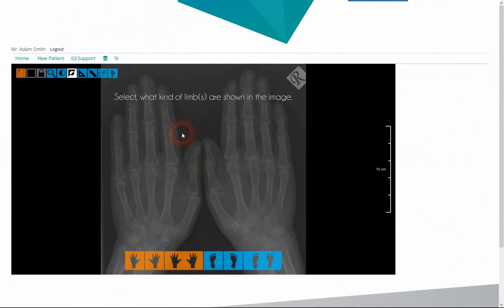After selecting the image we want to evaluate, the first step is to define the subject of the image: feet, hands, one or both limbs. In this case, this is an image with both left and right hands.